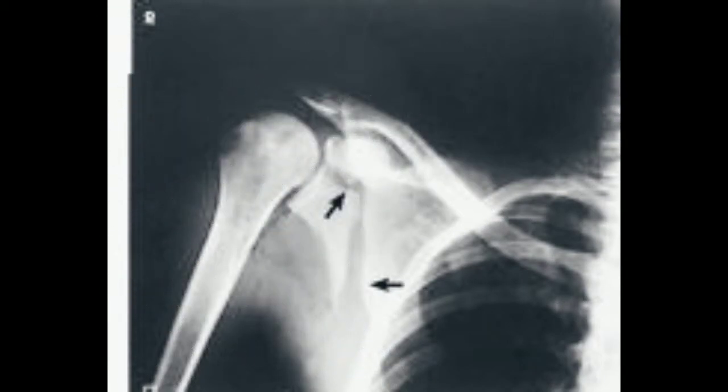Sometimes patients are unable to abduct their arm at 90 degrees, but have them do it as best as possible, because we do need the lateral border not superimposed by the rib cage. For this AP scapula, we can see an apparent fracture through the glenoid cavity, and it is extending inferiorly. Definitely double check your department protocol, whether it's for like an ED setting. They may want to include the SC joint.